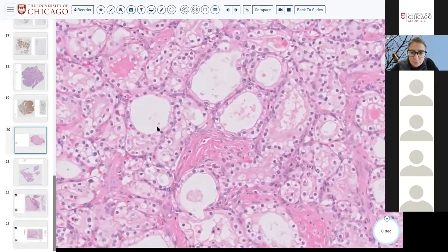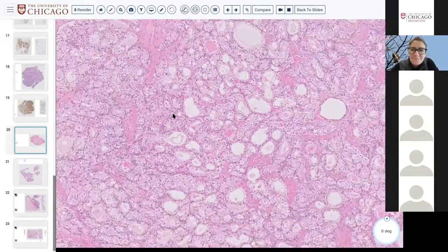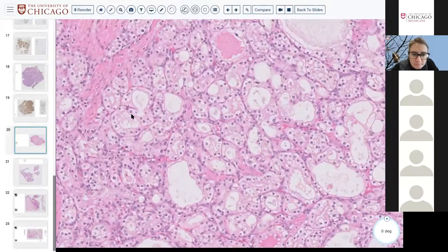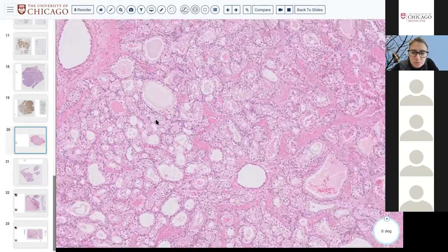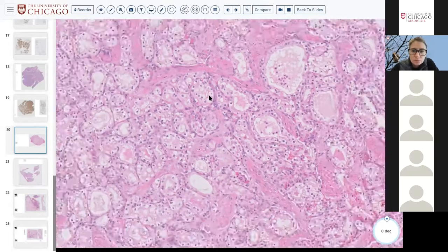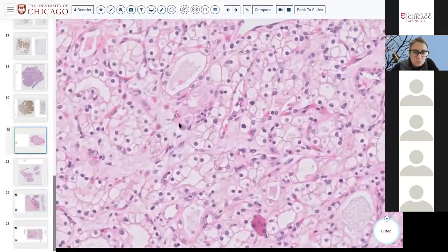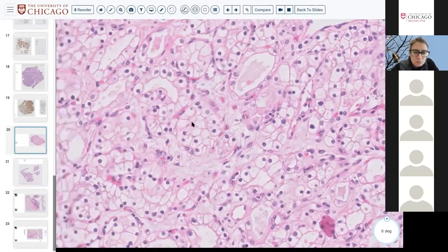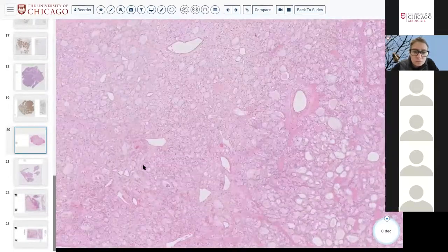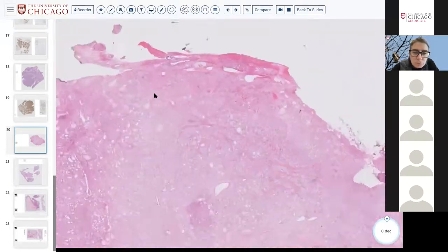This one looks very pale on low power, still very pale when zooming in. Glandular, almost follicular, composed of a monomorphic population of cells that are very cleared out, foamy, with pretty large nuclei but without any atypia or mitosis of note. If it's what I'm thinking, there should be fibrovascular separation of these groups of glands too.